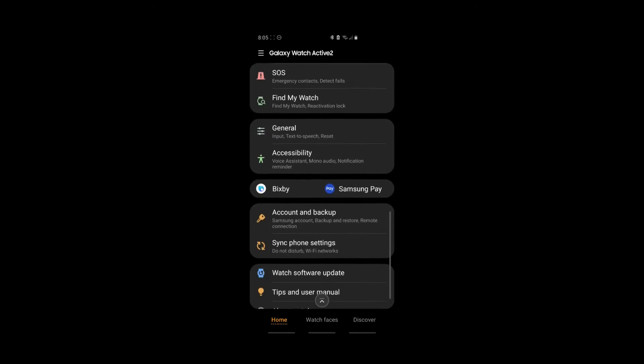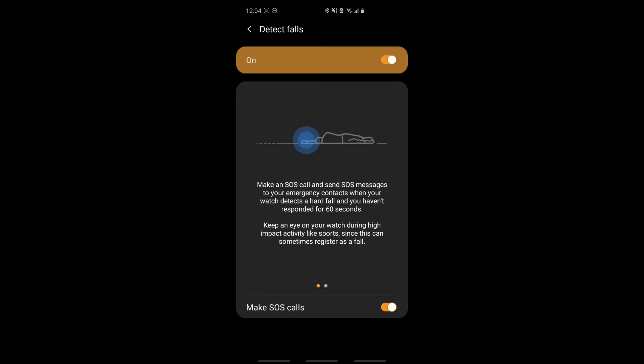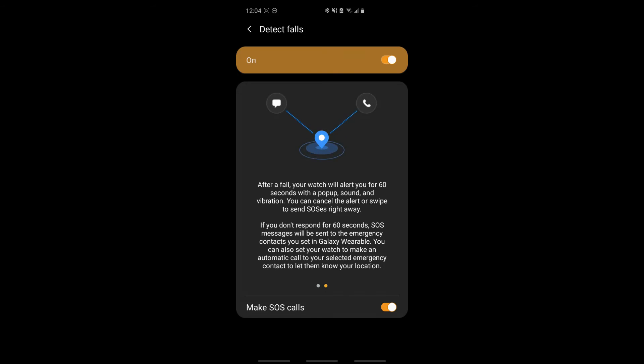Click on Detect Falls. This will make an SOS call and send SOS messages to your emergency contacts when your watch detects a hard fall and you haven't responded for 60 seconds. Keep an eye on your watch during high-impact activity like sports, since this can sometimes register as a fall. After a fall, your watch will alert you for 60 seconds with a pop-up, sound, and vibration. You can cancel the alert or swipe to send SOS right away. If you don't respond for 60 seconds, SOS messages will be sent to the emergency contacts you set in your Galaxy Wearable. You can also set your watch to make an automatic call to your selected emergency contact to let them know your location.